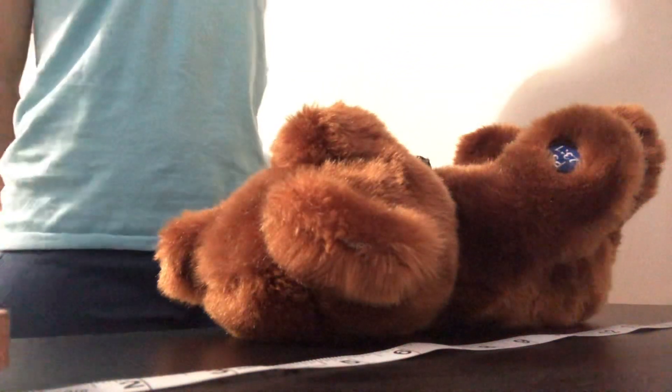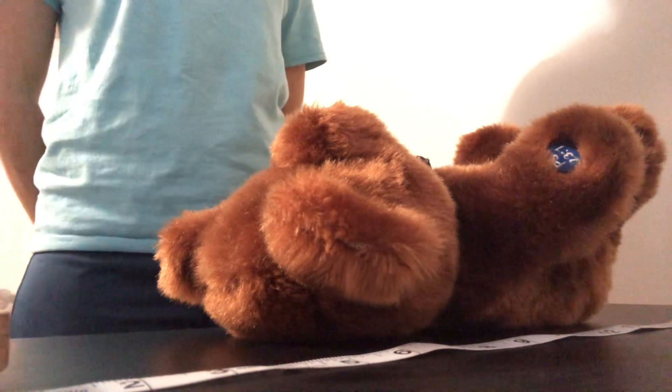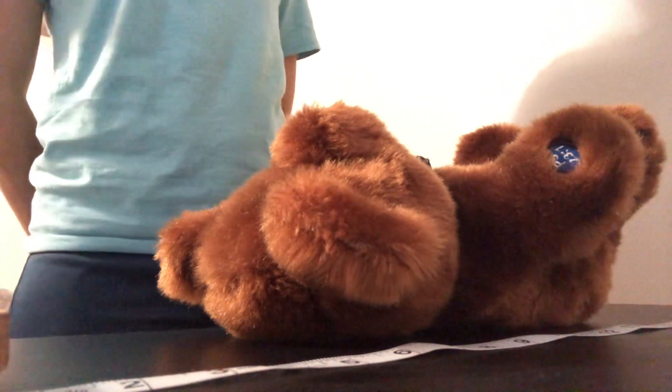Hello, so what I'm going to be doing now, I'm going to measure the baby's length. So first, I will start by washing my hands. I don't have a sink around me, so I will have to skip that part for now.